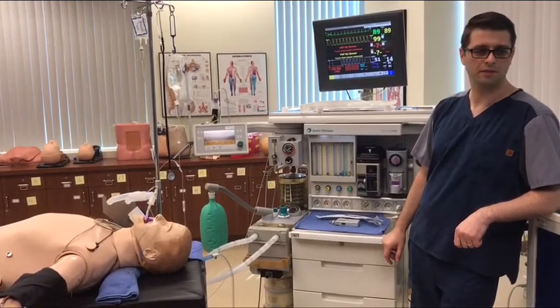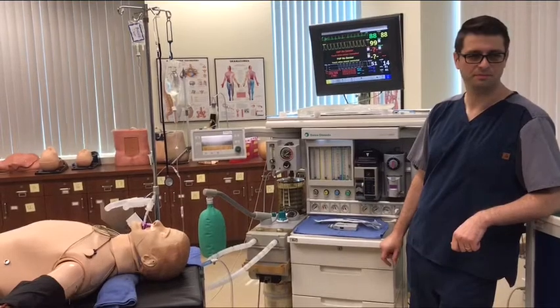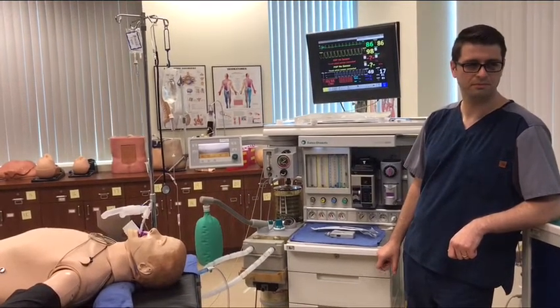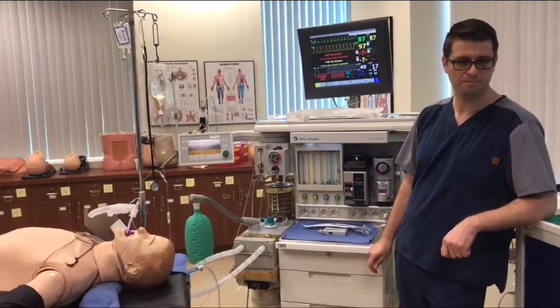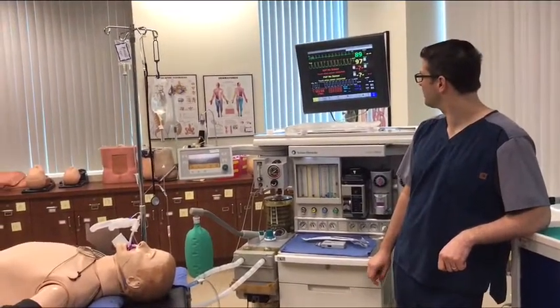If it's a spontaneously breathing patient, do spontaneously breathing patients require negative or positive pressure? Negative pressure. Negative, yeah. So we don't want to add any positive pressure to the circuit. So no. We answered that ourselves. Are you happy? Ready to activate the patient?